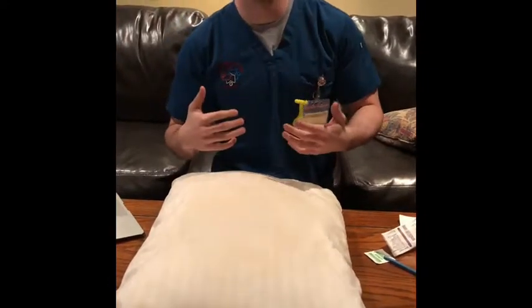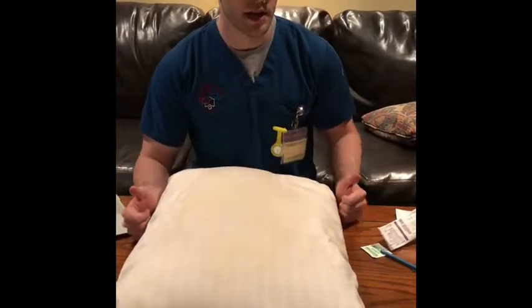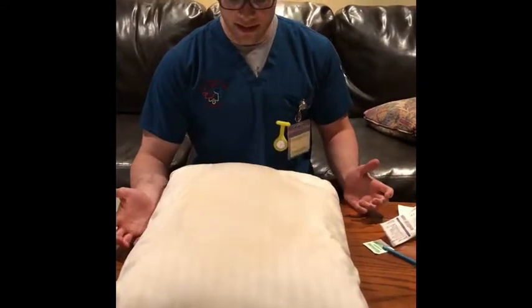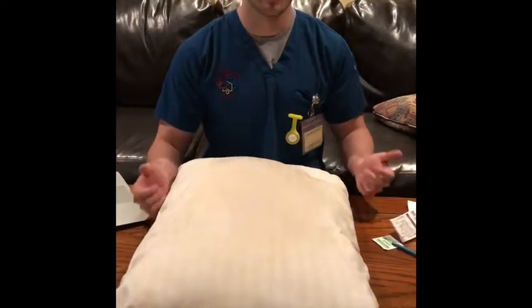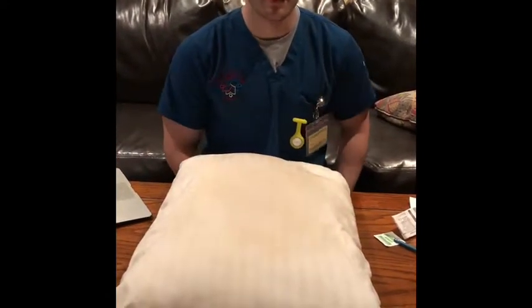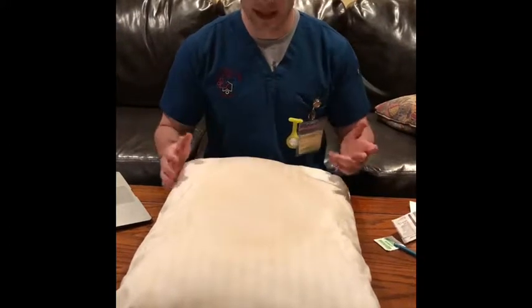And then after that, just deciding, since we are doing a subcutaneous, which site to do, based on his body build, as well as if it's within normal range for his age and gender. For this subcutaneous injection, we'll be doing an abdominal injection, as well as it could be the anterior portions of the thighs or the backside of the arm, but just for video's sake, we'll say it's the abdomen.